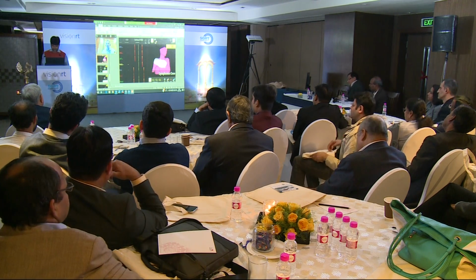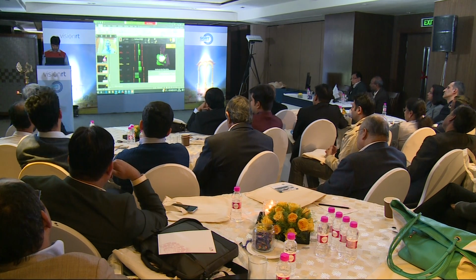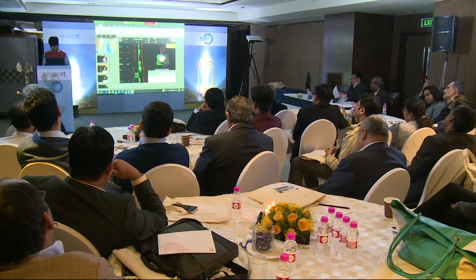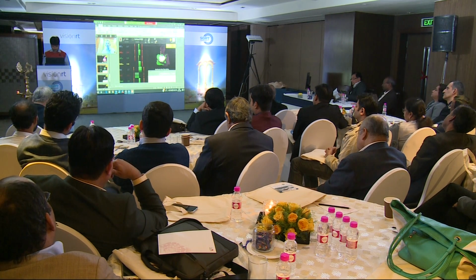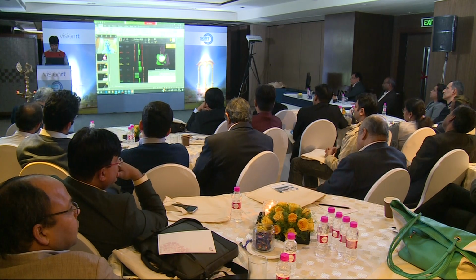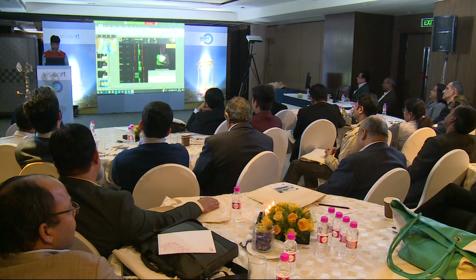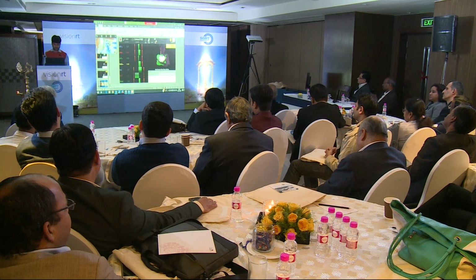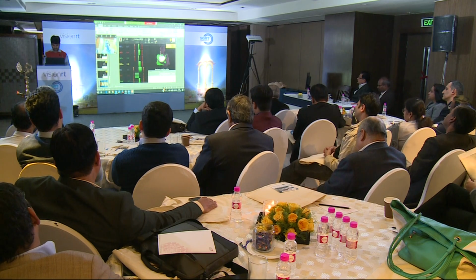If you go to slide 28, we basically will align this ROI in real time using the cameras to within about 3 millimeters, try to get her posture as good as we can with a single ROI. But we know the shoulder, the neck, the chin, the arm are all moving independently of one another. And how many times have we had to go in and out or have therapists go in and out and take multiple films to get the arm in the right position, the chin in the right position, the neck in the right position, because we're treating this large VMAT lymphoma down through the neck and into the axilla, and everything needs to be in the right orientation.